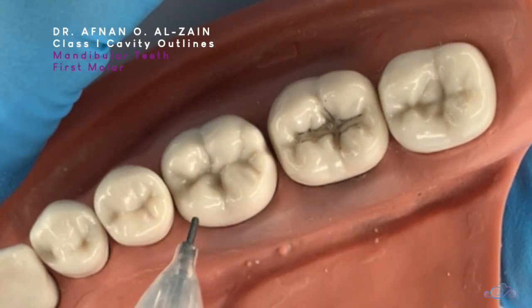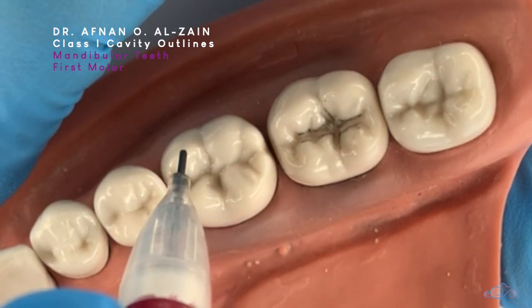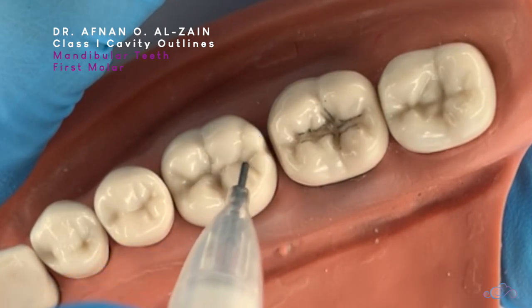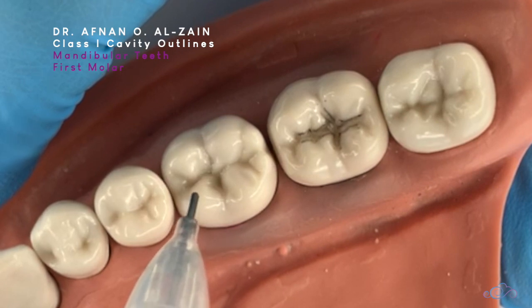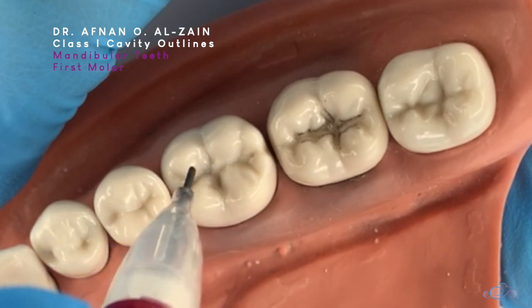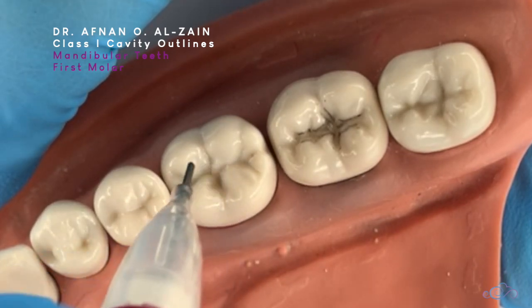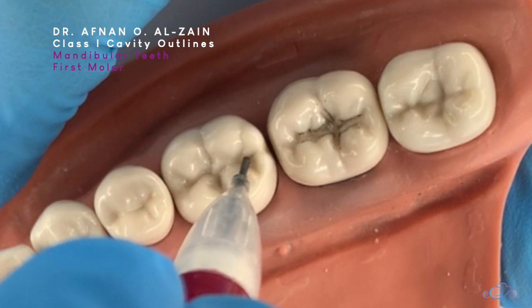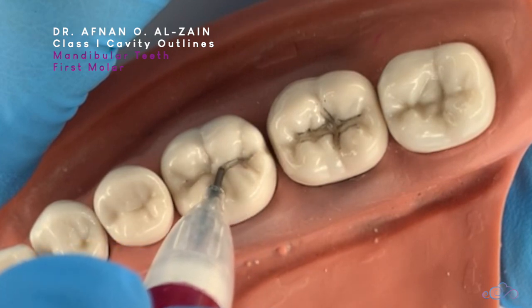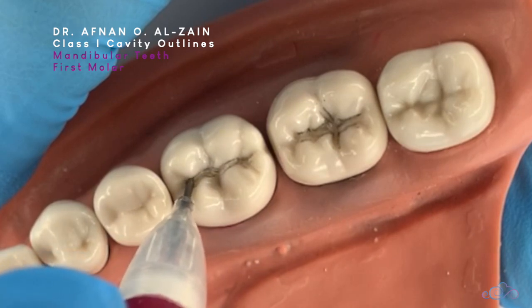Moving on to the first molar, or tooth number six. The outline is going to be a little bit different because there is the distal cusp in the first molar. When we start drawing the outline, we're going to start either from the center, from the distal, or from the mesial. We start from the central groove, going from one triangular fossa through the central groove to the other triangular fossa. We usually start with the central groove.